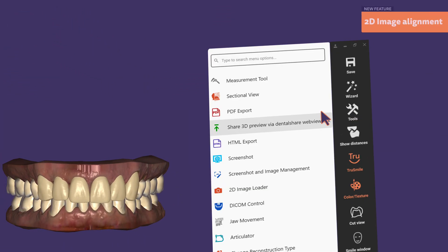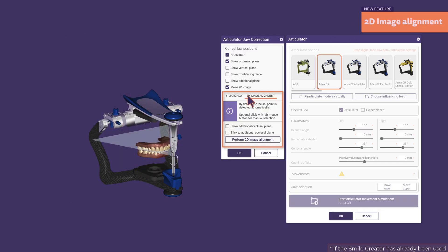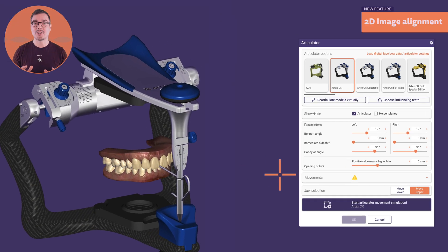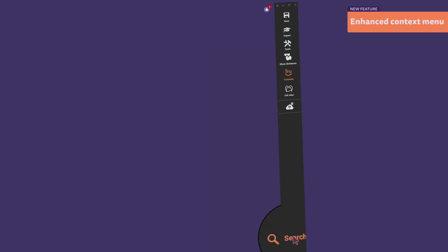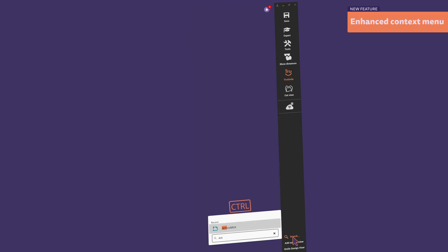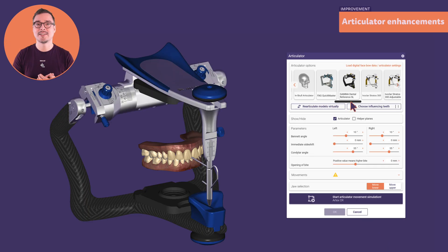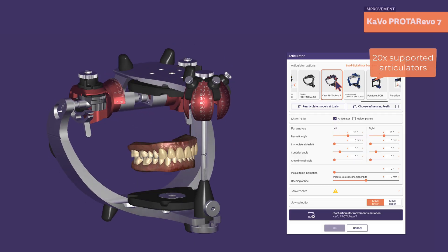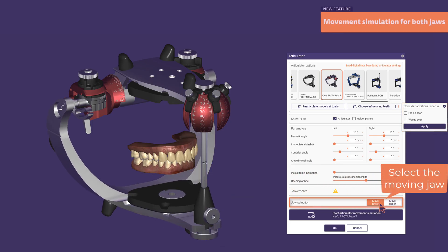If you start the virtual articulator after finishing the smile design, the scan alignment has been done automatically based on the patient's picture. You can also find the 2D image alignment option in a new tab. Now you can filter the tool and context menu just by typing, or access them using the search icon in the lower right corner or with the hotkey CTRL-Q. The articulator menu also features a new CAVO articulator, a simplified interface to consider additional scans like pre-ops and wax-up scans, and the ability to decide if the lower or upper jaw will perform the movement simulation.